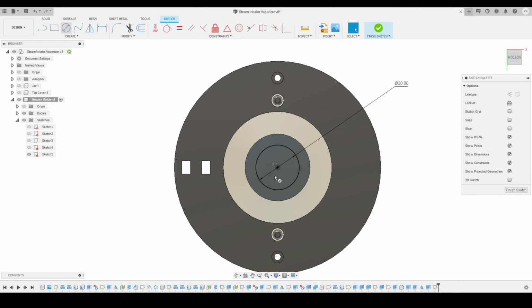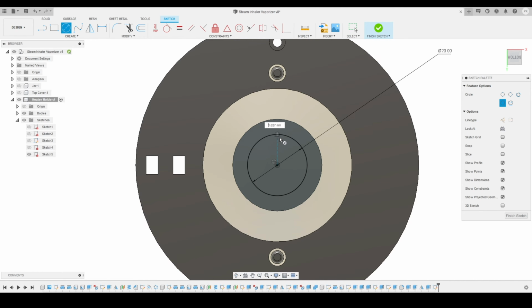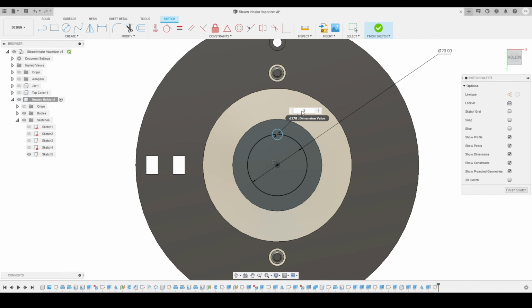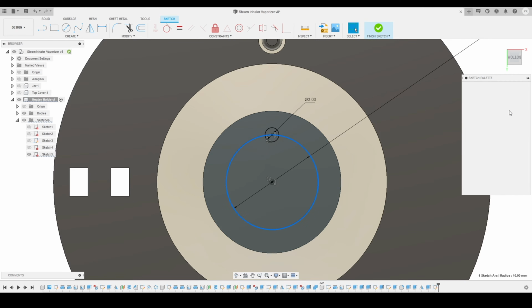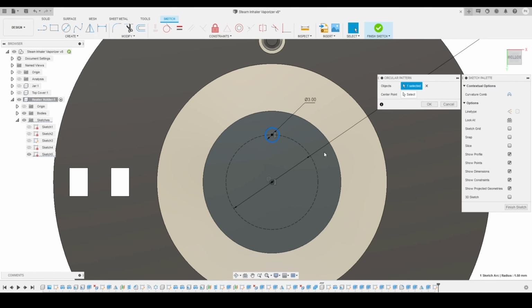I am going to create one more circle over here like this, and we'll define the diameter of this circle also. So this is 3 millimeters, and we'll make sure that the centers are on the same vertical position. Here you can see I will change this circle to a construction line, and then I will select the circle, go to create, and activate the circular pattern.